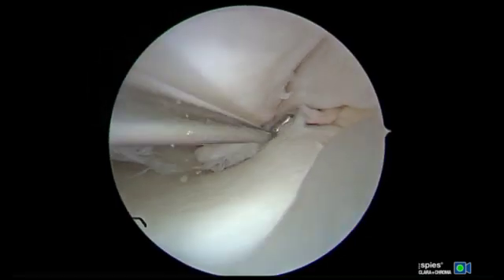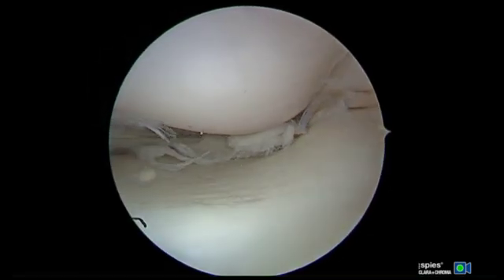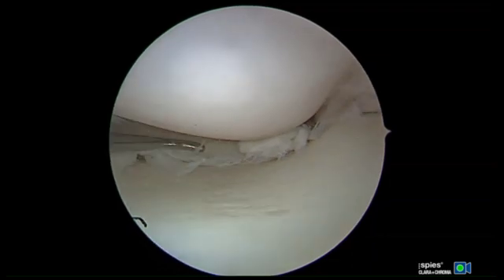In this video, we present our technique for repairing horizontal cleavage tears with all-inside circumferential compression sutures utilizing the Smith & Nephew Novisage Pro all-inside device.